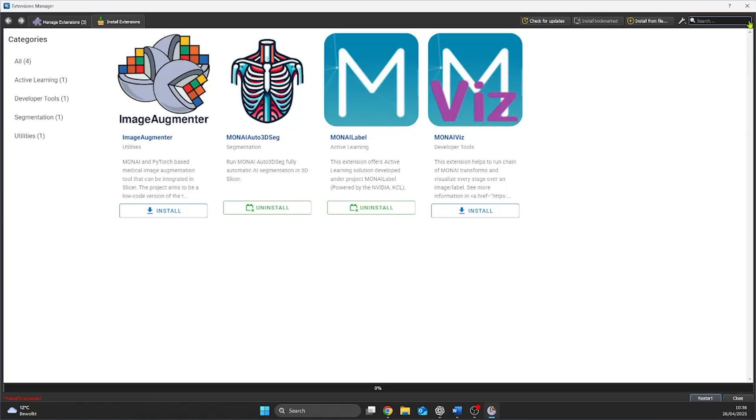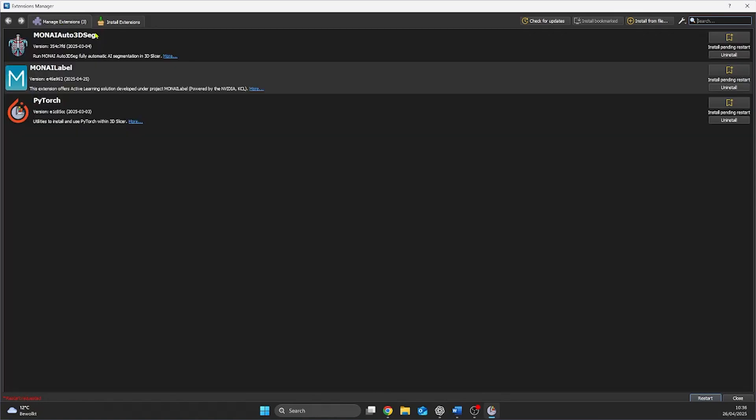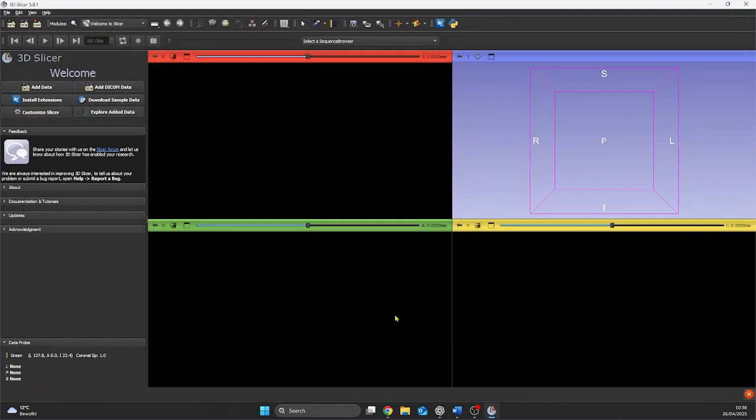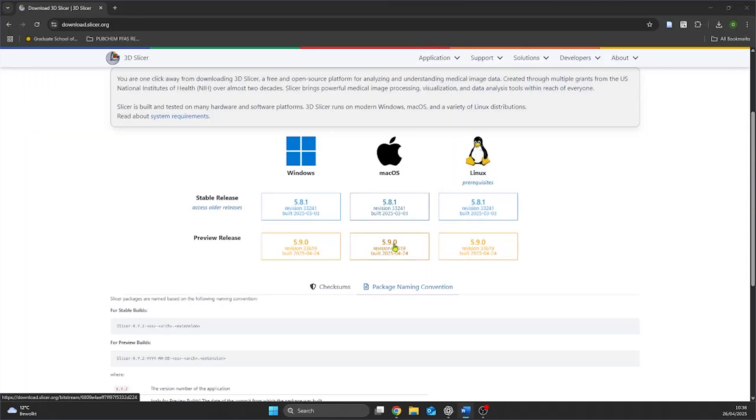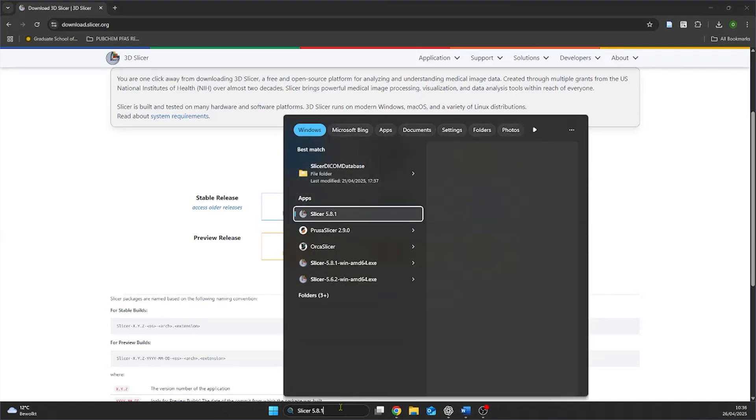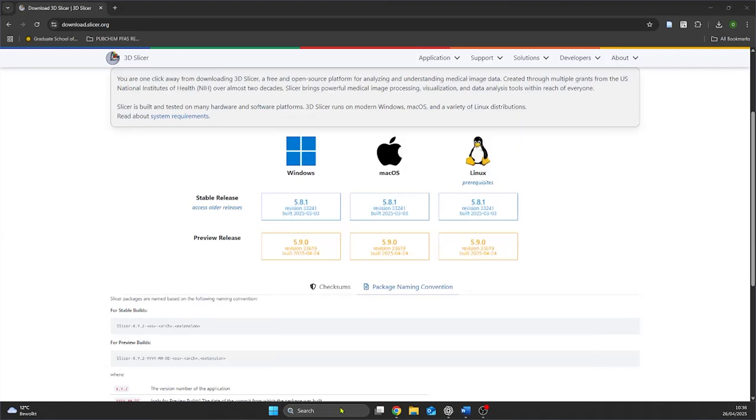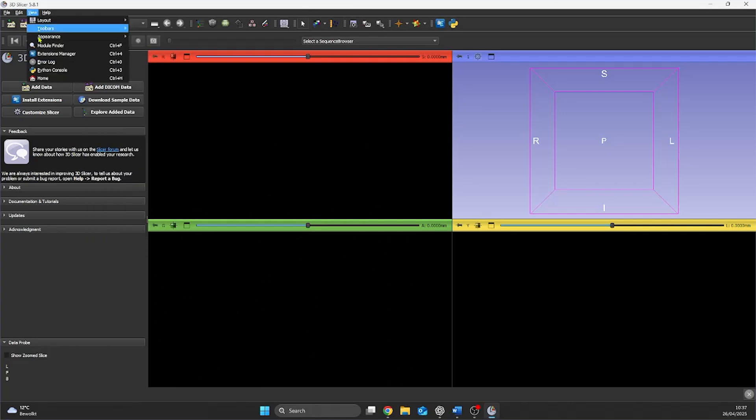In order for these extensions to work we need to restart Slicer3D. And then we see that the extensions become available within the Slicer environment.